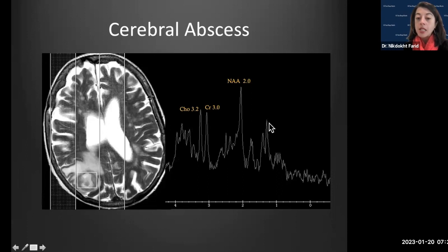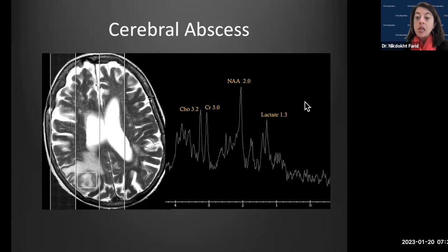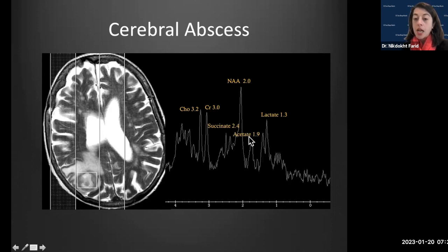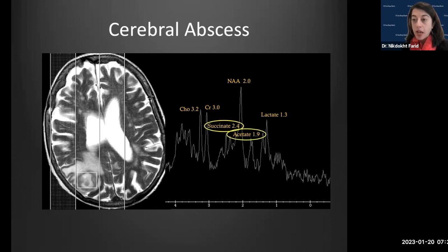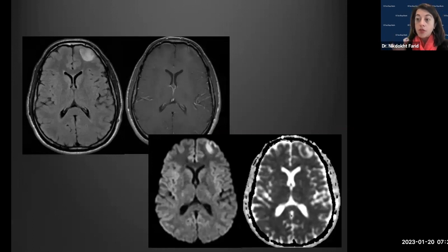MR spectroscopy was confirmatory. We see normal metabolites: NAA at 2, creatine at 3, and choline at 3.2. Importantly, we also see lactate, which indicates anaerobic metabolism and can occur with any necrotic process. More specific are the amino acid metabolites: acetate at 1.9 and succinate at 2.4, which are quite specific for a pyogenic abscess.